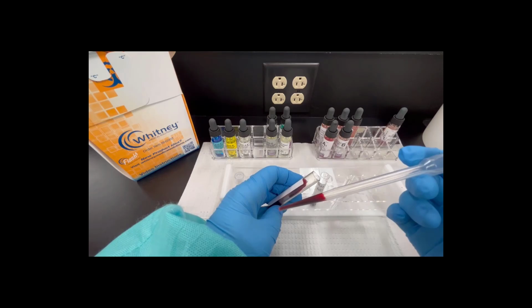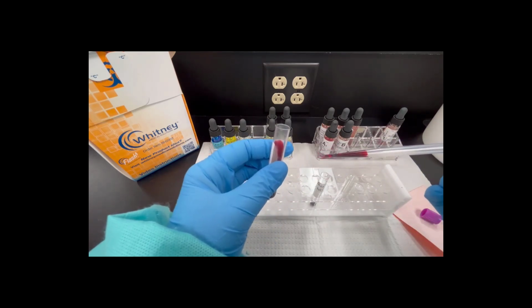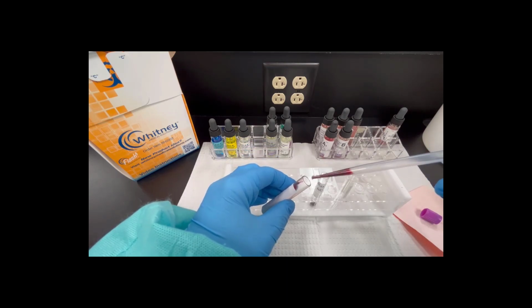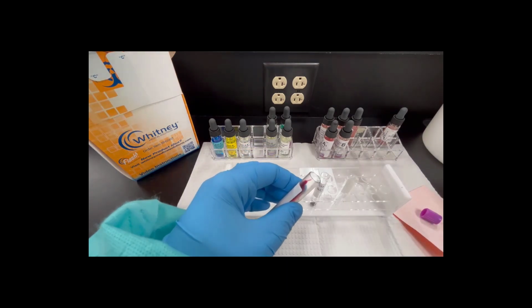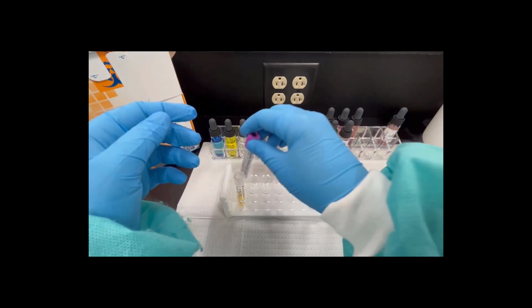We don't ever throw away a pipette full of cells. We don't want to ever do that. Cells, plasma, things like that, we always put them back in to make sure we're not wasting any. Put that back in my container. Put the lid back on because as of right now, I'm done with this guy.